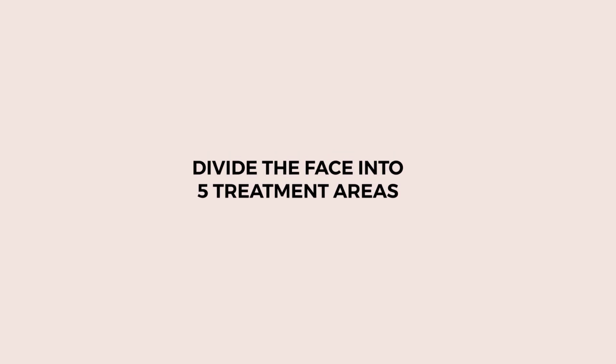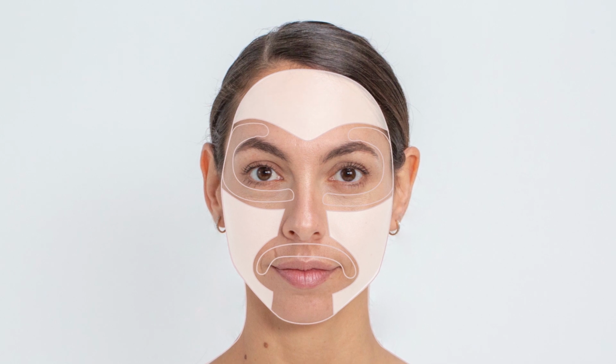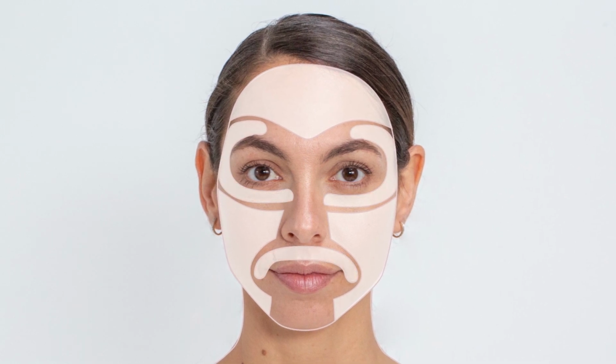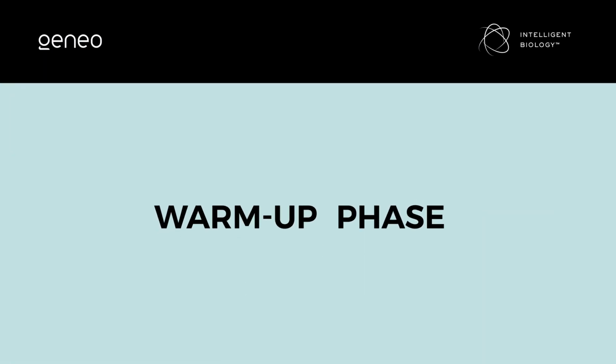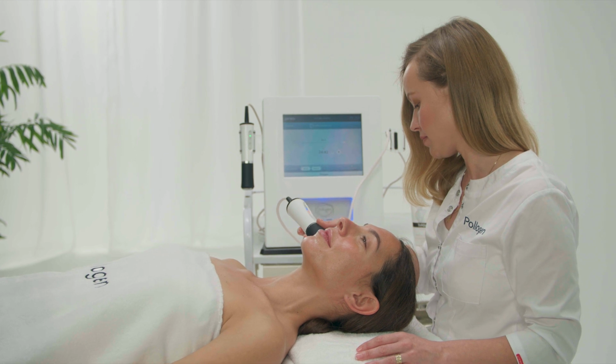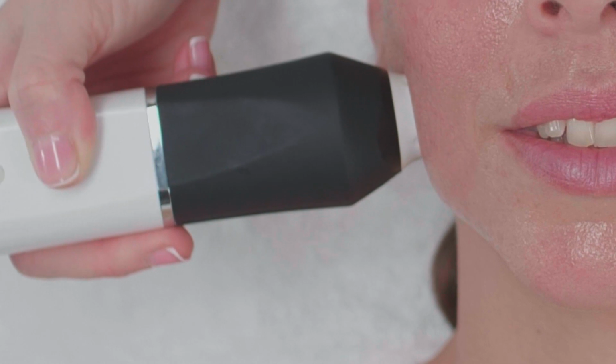Divide the face into 5 treatment areas: right cheek, left cheek, forehead, around the eyes, and around the mouth. 5 minutes of treatment per area. Start the treatment on the jawline. Place the 4 electrode tips against the skin and apply slight pressure.